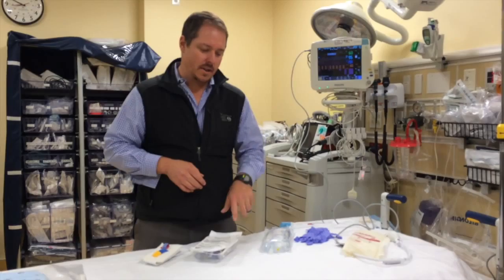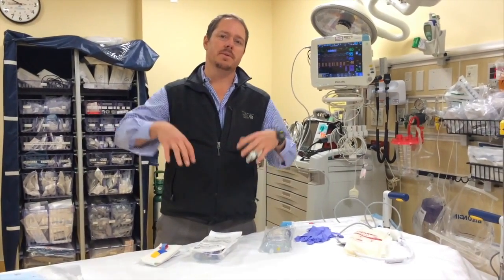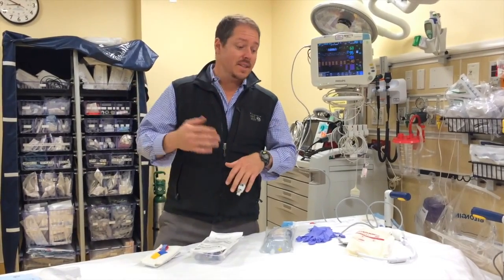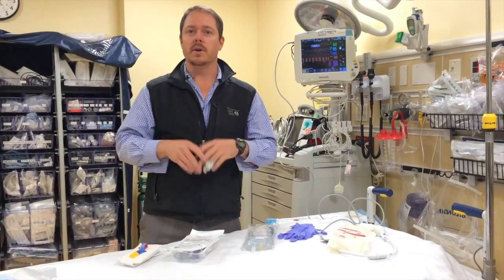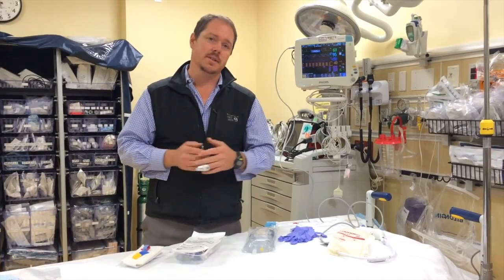We're going to do a quick insert on how to set up a central line. We don't do this a lot anymore. When we were doing early goal-directed therapy, we would set up CVP lines all the time and became experts at it. Since then, we'll do CVP lines maybe once every blue moon, and same with arterial lines. We're probably doing more arterial lines than CVP lines these days, actually.